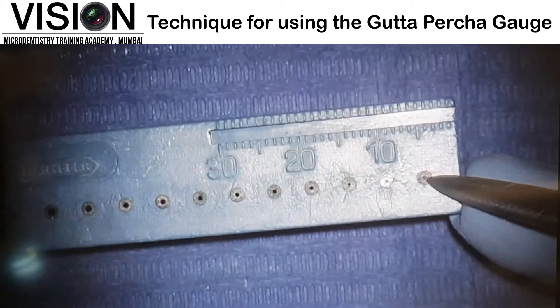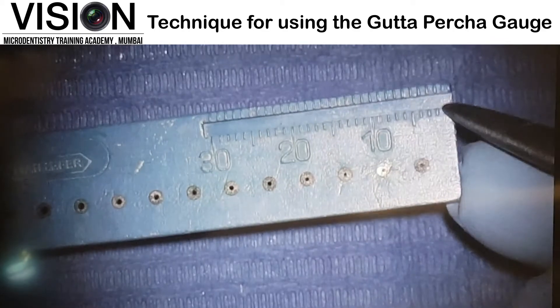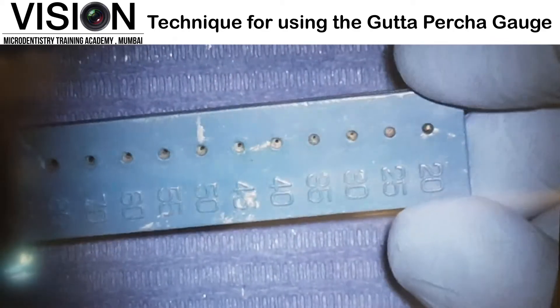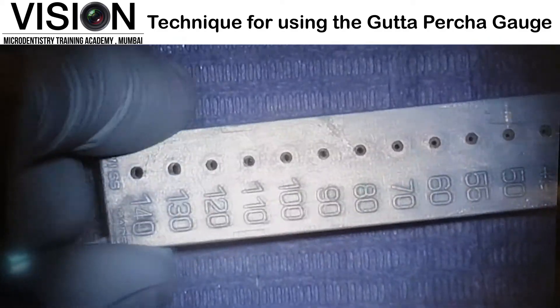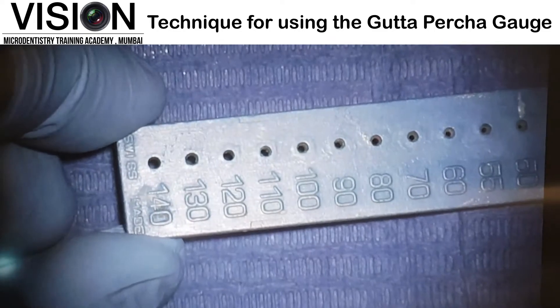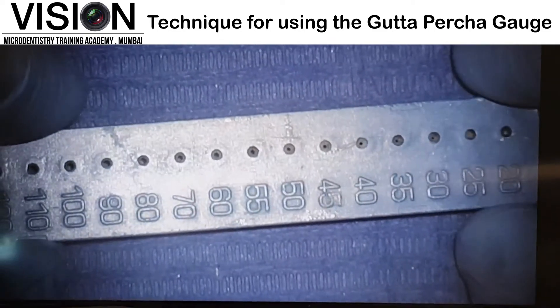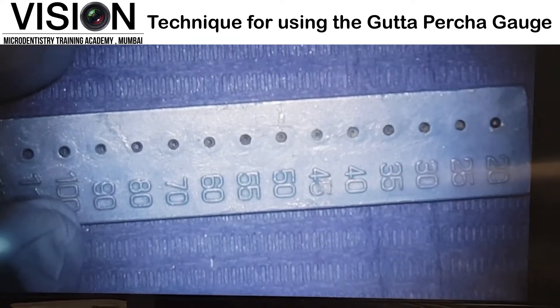So this is the smallest one right here, and there is also a measurement ruler given right above. Once you flip the GP gauge on the other side, you can see all these numbers starting from 20 and going up according to ISO sizes to 140. Now the way we are supposed to use the Gutta Percha gauge is — first we need to choose our Gutta Percha point.